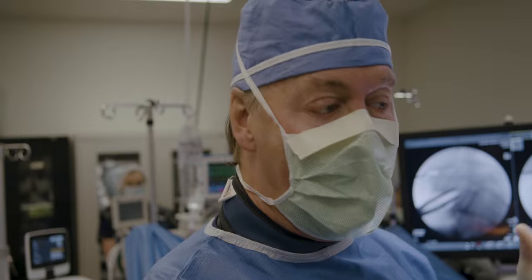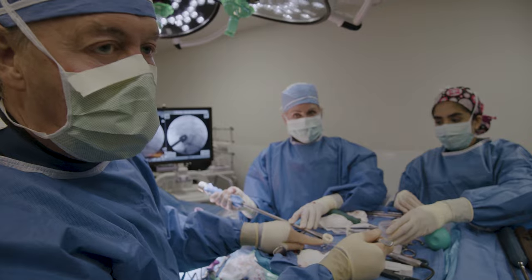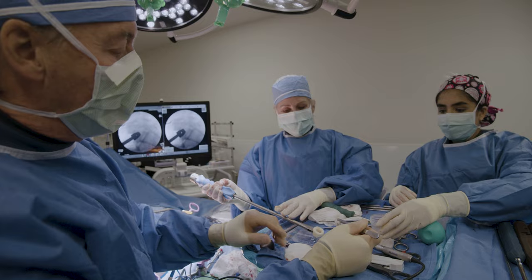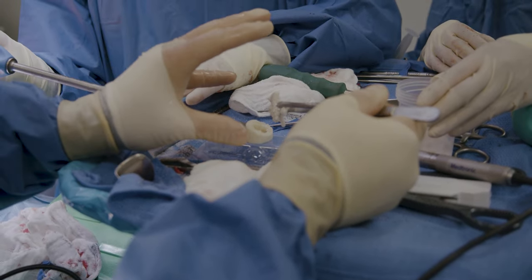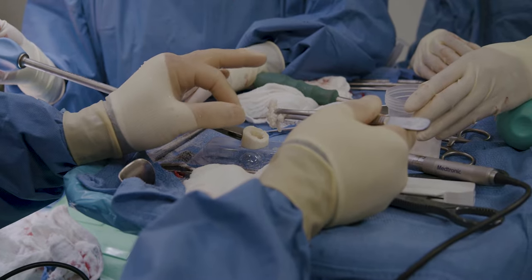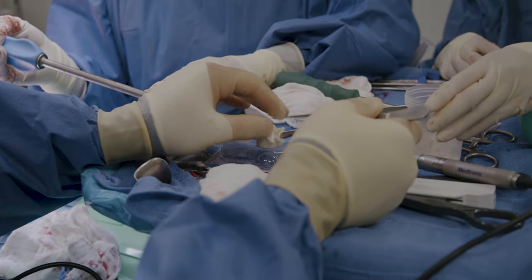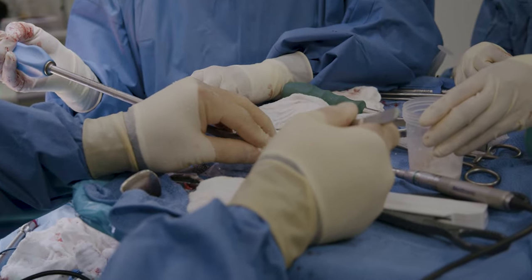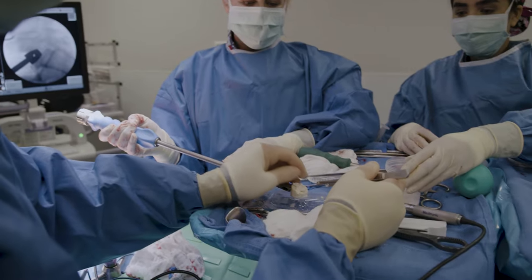Here we have the bone graft we're going to insert — we've shaved it to be a little more lordotic to give the correct angle. We place the center, which is open, with bone graft which is BMP — bone morphogenic protein — the human protein that makes bone grow, mixed with a little allograft bone and some demineralized bone matrix. We pack that in, and this will stimulate the patient's own bone to grow right through this implant and up into both vertebrae to provide a fusion.